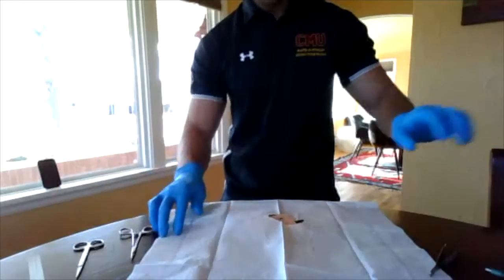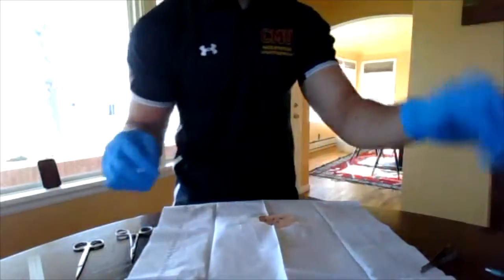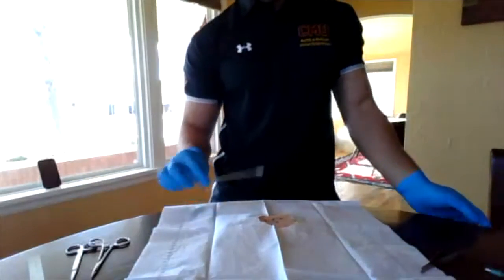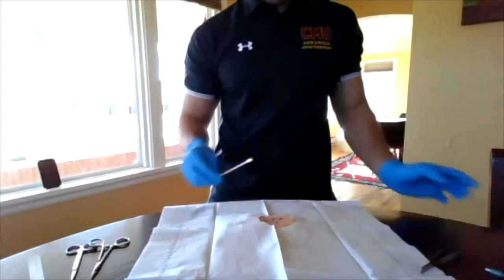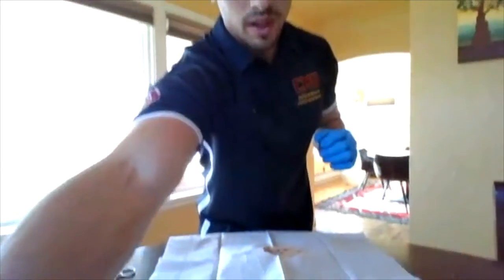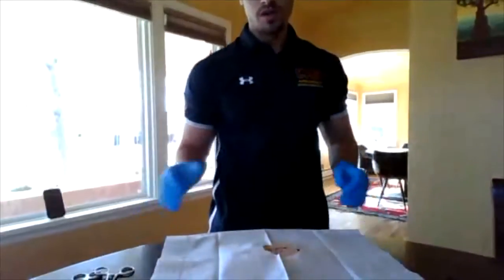Now at this point, the next step is to place an antibiotic ointment on the area with this Q-tip. And then you'll place a bandage on it. And then Emily will give you the follow-up instructions.